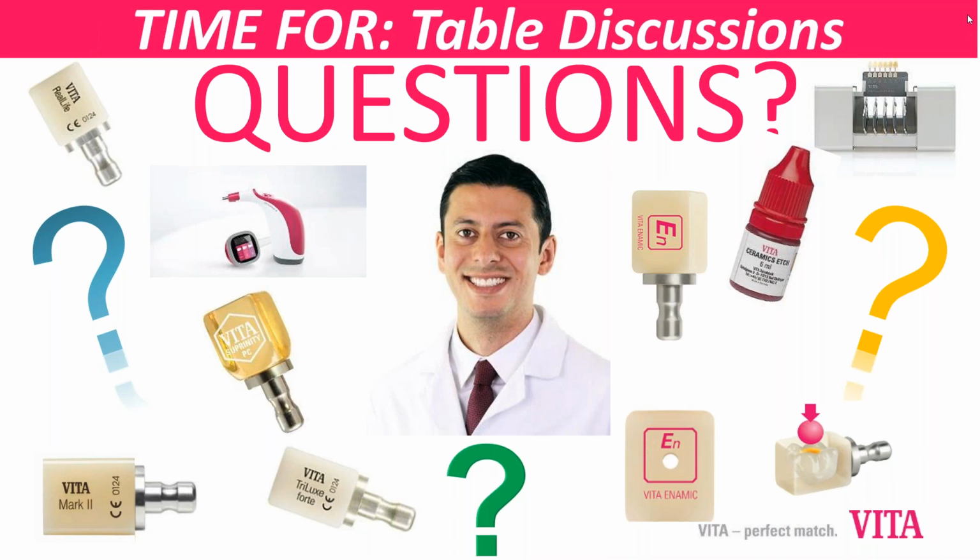And then, as you were saying, Jim, with Suprinity or lithium disilicates, why 20 seconds? Because there's less glassy matrix, so there's no need to etch for a longer period of time. And then, of course, zirconias, they are not etchable, right? We will go in depth on that in a later webinar, but we need to air particle abrade.